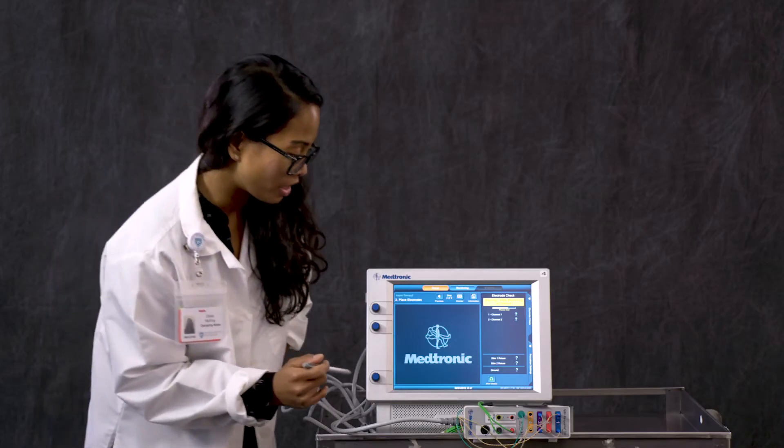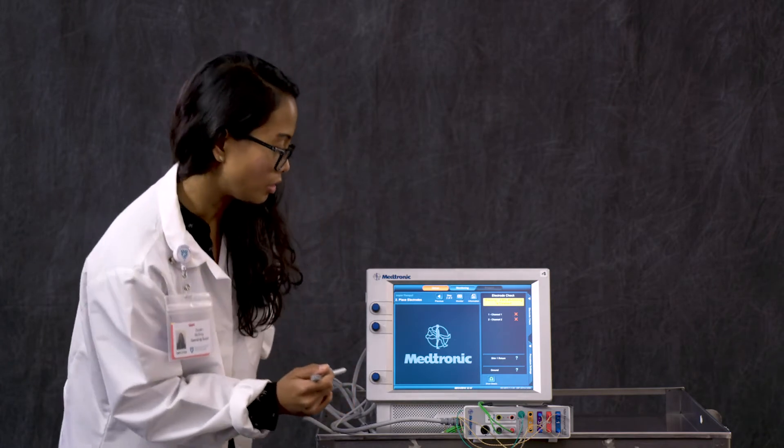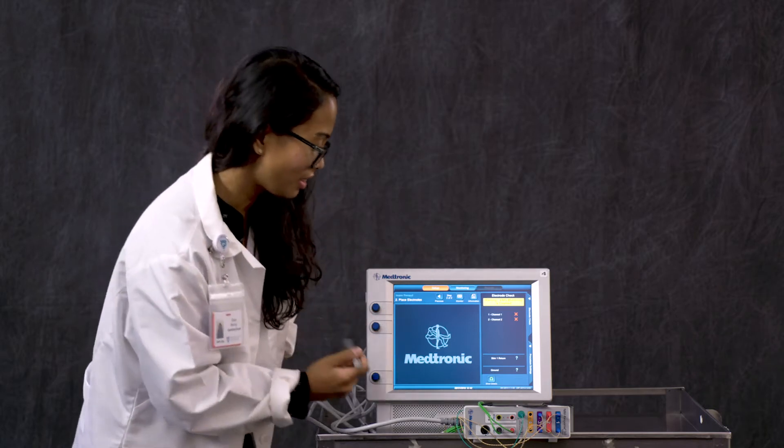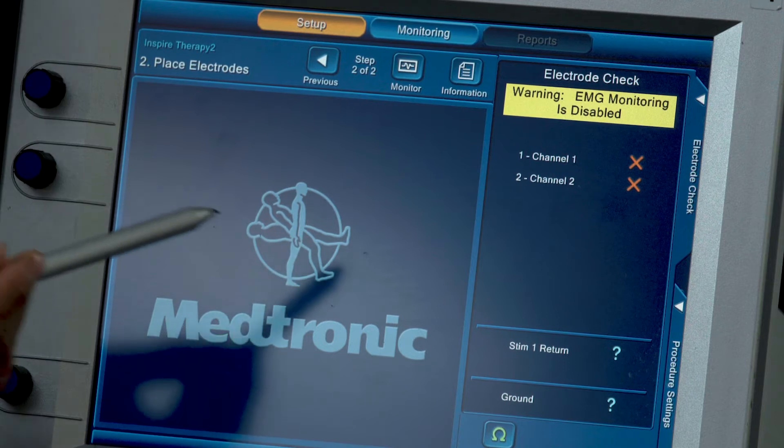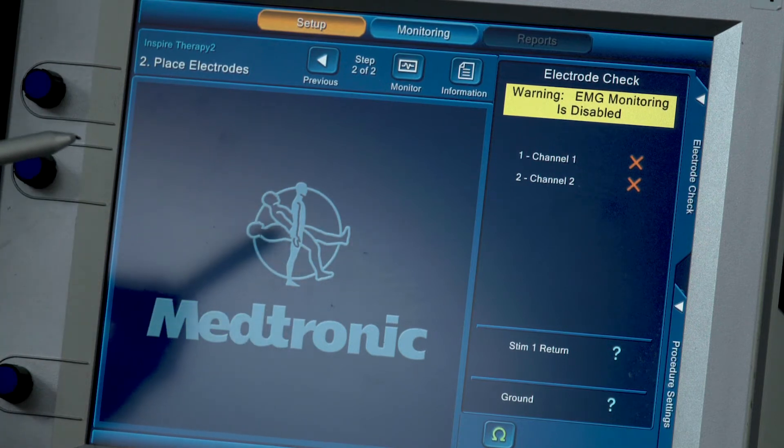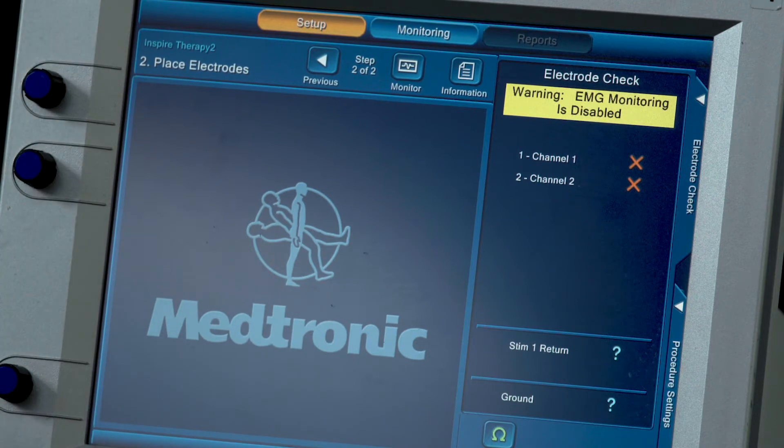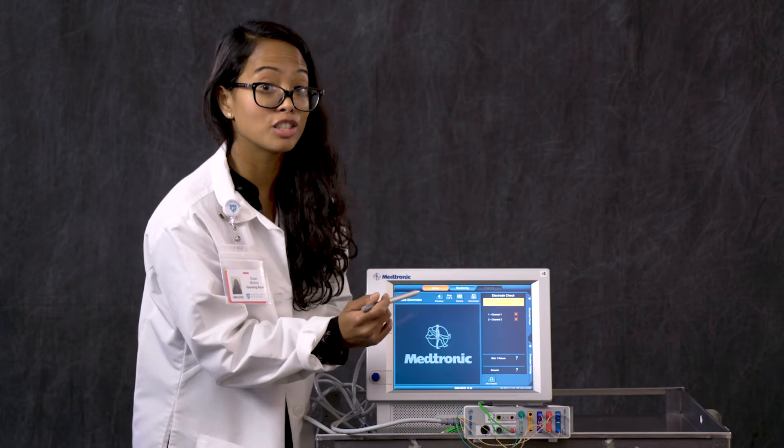Now that we are here on our setup screen, the first thing that you want to do when you are here is take a look at the screen. Here we have our electrode check panel. This is usually what comes up right after you have made a procedure, and since we haven't plugged anything in yet, you are going to get these X's which means we are not hooked up properly.